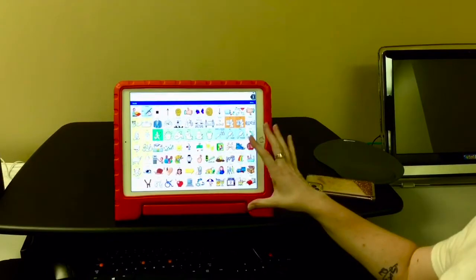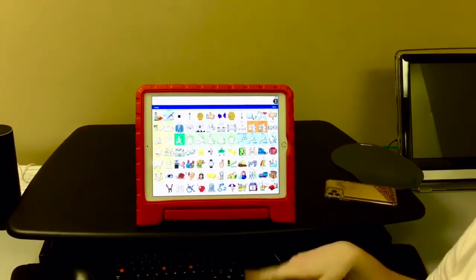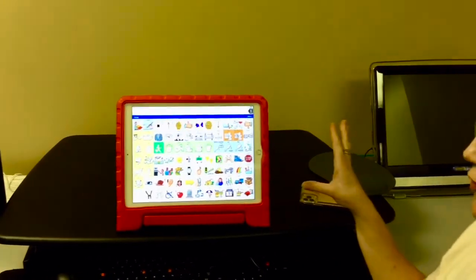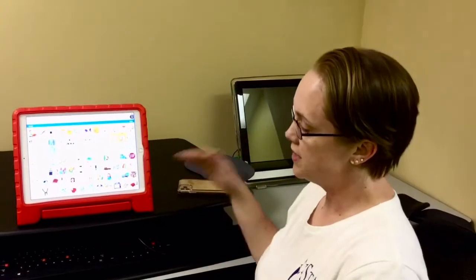And so they're all kind of set up. There is a motor plan. So I always know that 3 over and 3 down is here. Nouns are here. And so people that use this program, they just learn where these words are, so that even if you took the pictures away, their finger still knows where to go because their brain has built a motor plan for that.